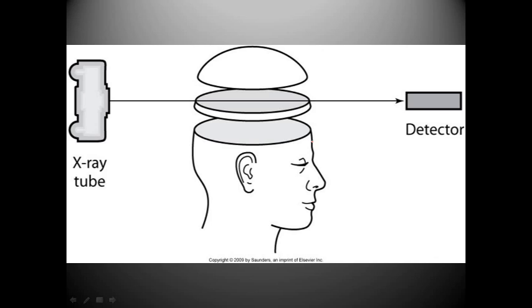I'm sure we all have grasped the concept now, but in terms of CT, we have the X-ray tube and a detector on the other end. The detector and the computer work cohesively to transform the X-ray photons into readings, which the computer can use to generate an image.